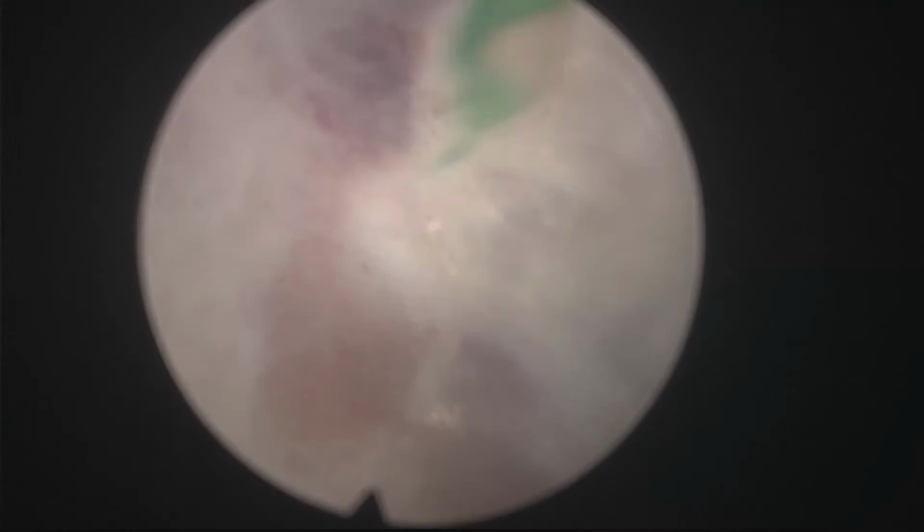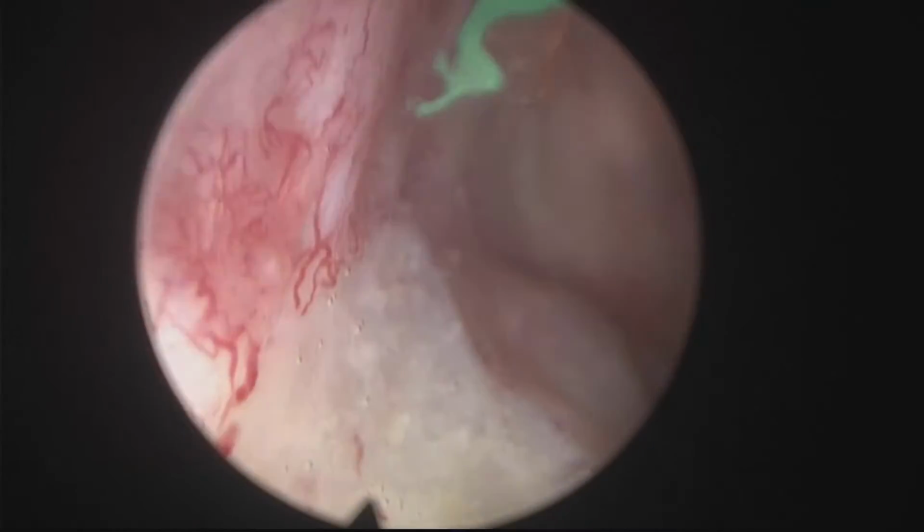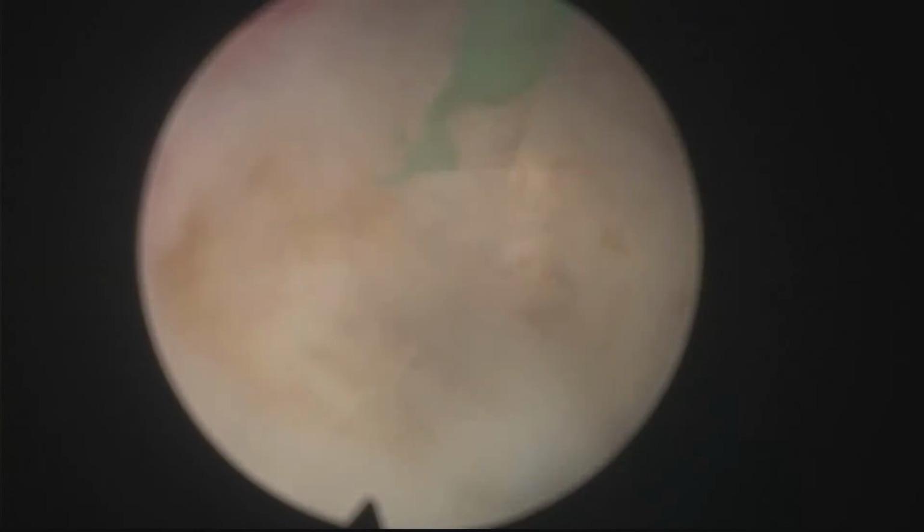and trying to complete the white line. Here I didn't mark the anterior part. Initially I thought it would make sense to check as I go. You see, this is the marking I made. The other side is not complete yet, but you see how the adenoma is touching.